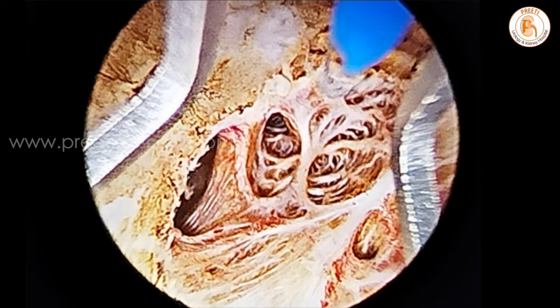In the same case, while giving the bladder neck incision it has gone deep — that is the first one. While elevating the median lobe, even if it is a precise incision, a superficial layer of perforation has happened.